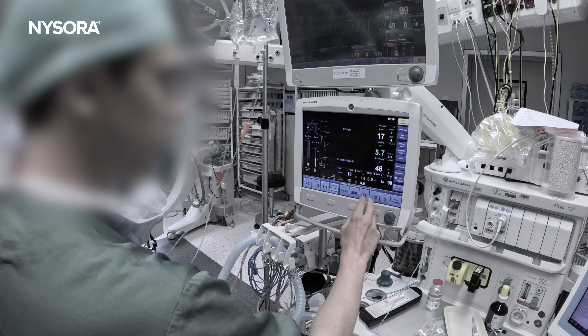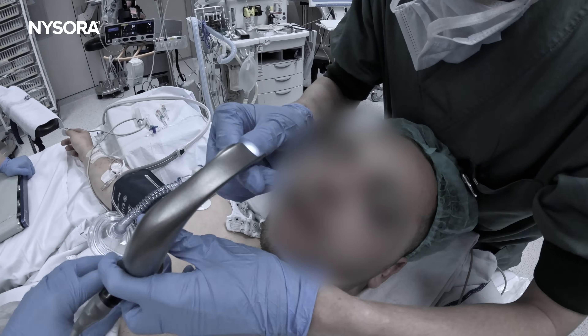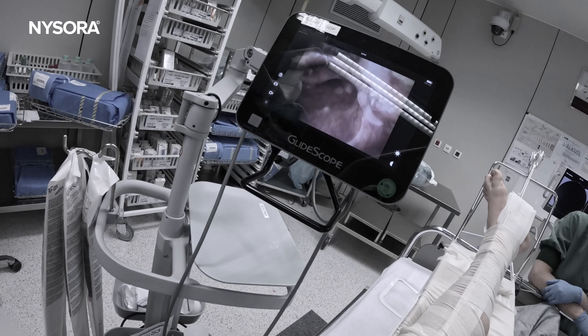Thanks to early recognition of the difficult airway, quick adjustments, and the use of video laryngoscopy, we were able to avoid a more serious situation. Managing an unexpected difficult airway can be stressful, especially in emergency settings. However, with the right tools, techniques, and a calm, methodological approach, you can successfully navigate these challenging situations.